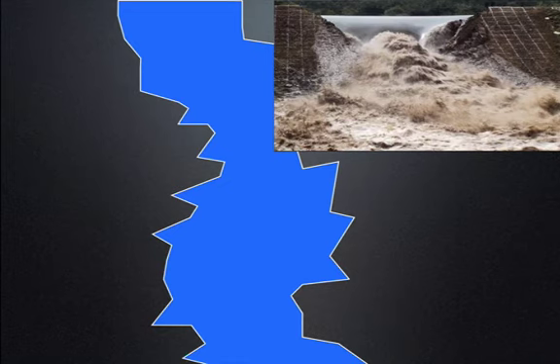But just because your IVC is plethoric and non-collapsible does not mean that you have a fully loaded tank. For example, it could also be that downstream they've built a dam or they've closed off the floodgates, so all the water is now backing up. This would be consistent with a pulmonary embolus or tension pneumothorax or pericardial tamponade or pump failure where there is an impedance to forward flow. So the blood is backing up through the IVC. Even though you look at that IVC and you say to yourself, look, they have a high circulating blood volume, they may actually have a low circulating blood volume, and in reality, there's just an impedance to forward flow.